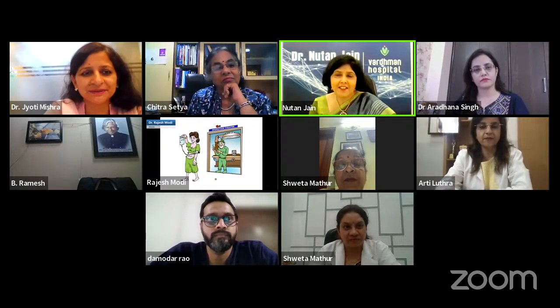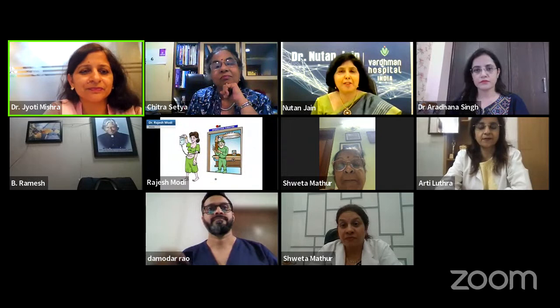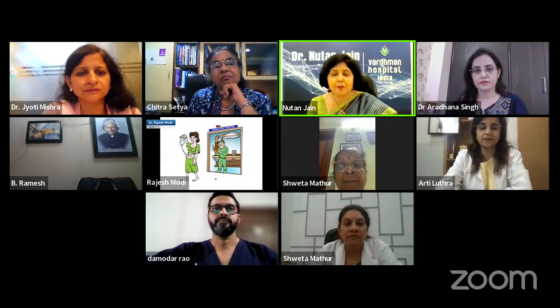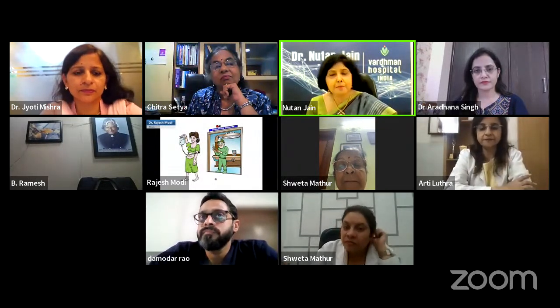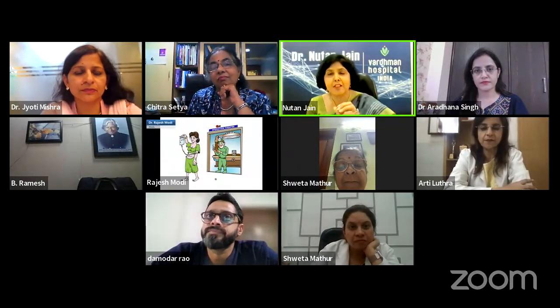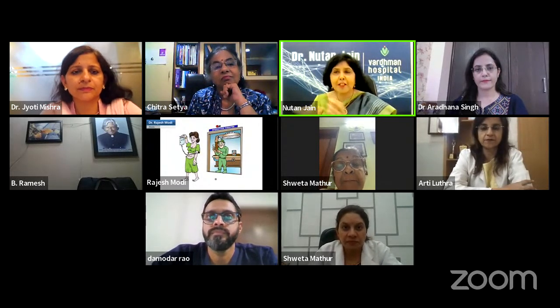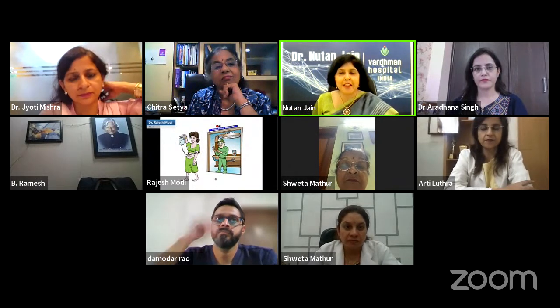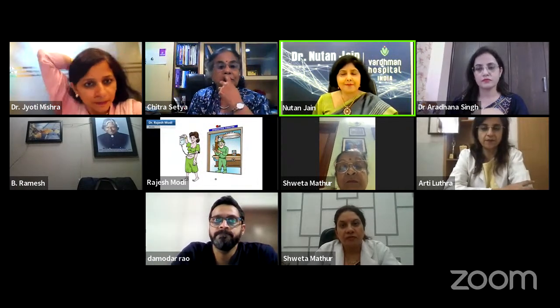Maybe if I can just add a point. Yes, ma'am. Maybe many people who are doing NDVH, they also feel that if you have any puckering or scarring or pain, tender ovaries, then maybe just put even a scope to do a diagnostic scopy before proceeding for NDVH. So this much we can do in a setup where we have all set up for laparoscopy and still we want to continue with NDVH also.